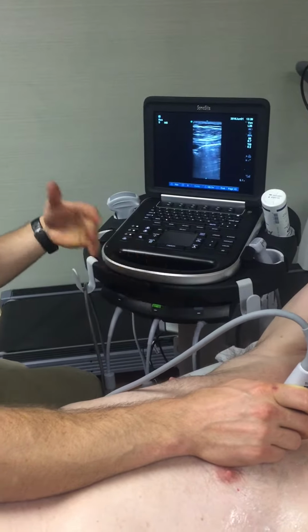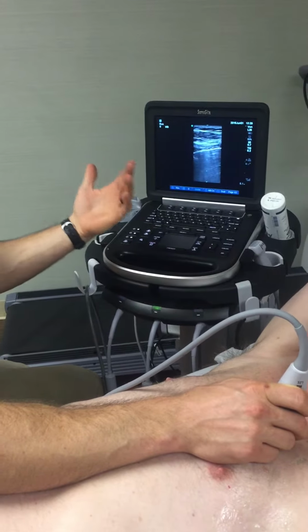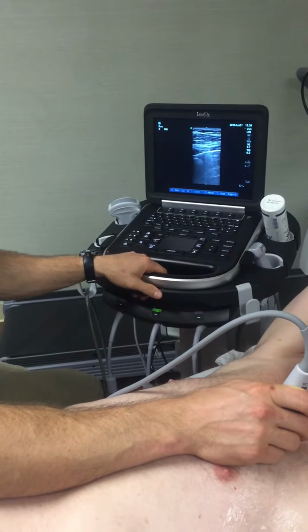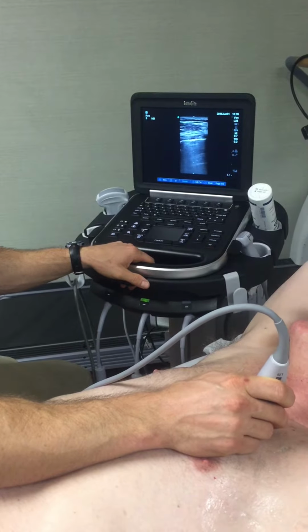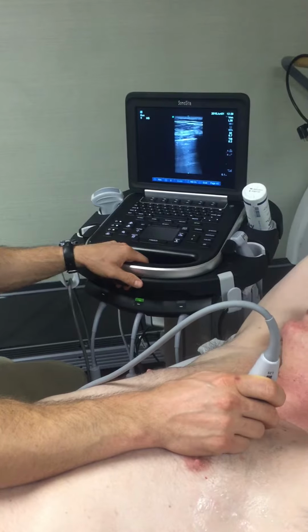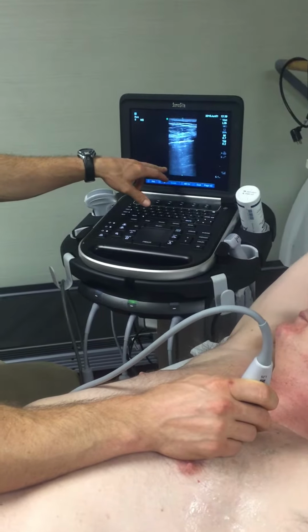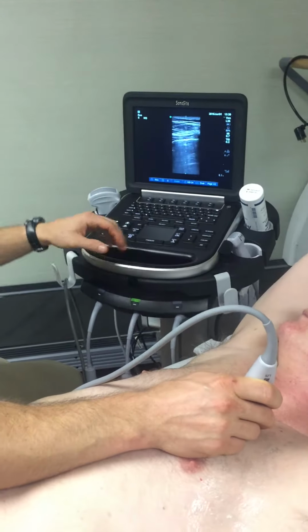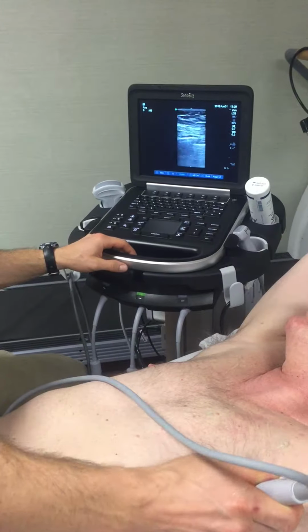So now if you're doing one for a general dyspnea workup, you typically want to do 4 views on each lung. We'll start with view number 1, which is typically similar to what we did. So this is the number 1 view anteriorly. Center it. You look for B lines. Sometimes you can catch a little A line here. You see the pleura moving. Then you slide down and basically track down the chest posteriorly.